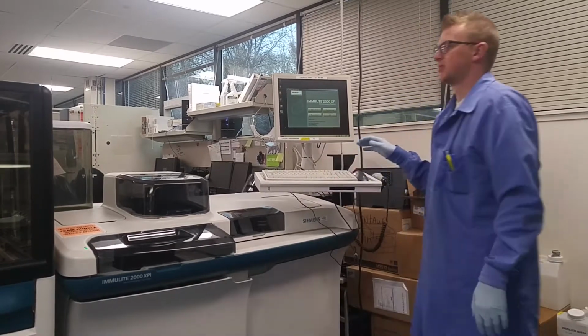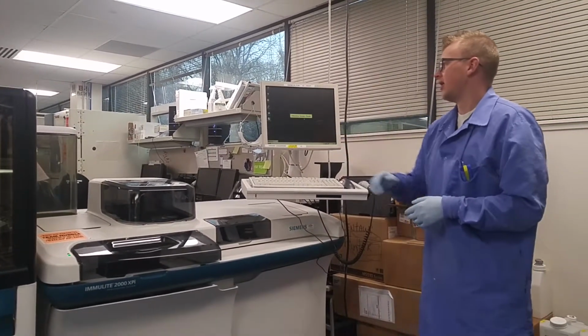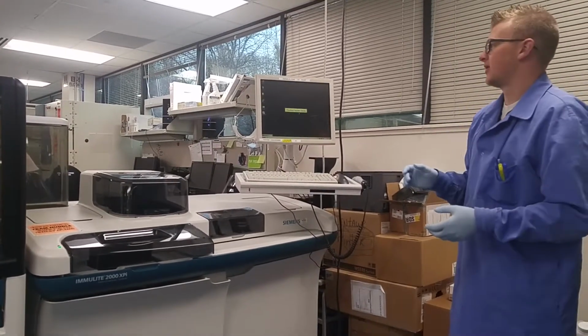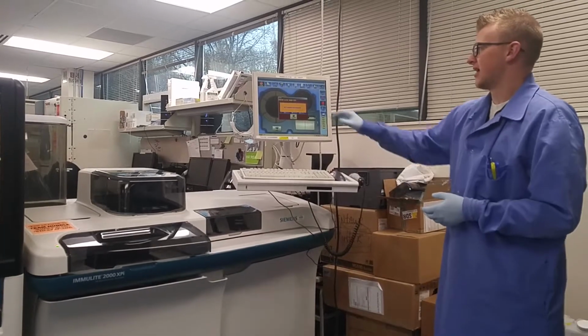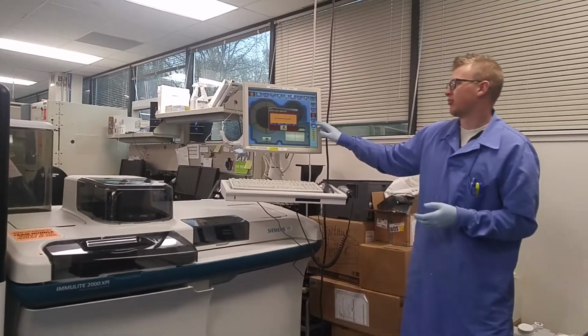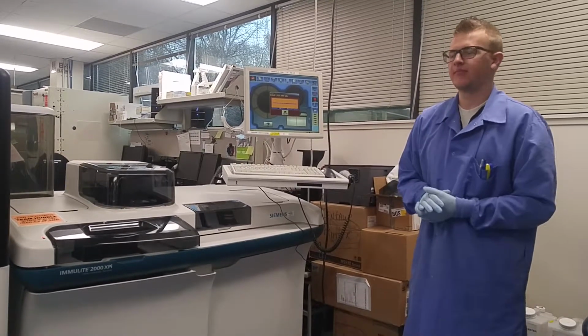Now back to our home startup screen once you've turned on the computer for the day. We're going to hit run Immulite 2000. It's then going to initialize a software program, and once it has initialized, you're going to prime your system anywhere from 5 to 15 times depending on the severity of the clot.